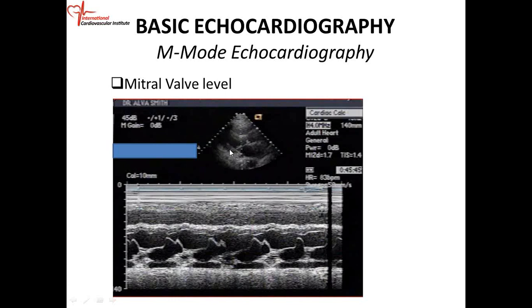So two-dimensional echo on top, your M mode echo is on the bottom. So this is the chest wall right here. It's not moving, so it's a straight line. Well, minimal motion. So it's a straight line. Then the pericardium, then the RV wall. Then you have the RV cavity right there, RV cavity.